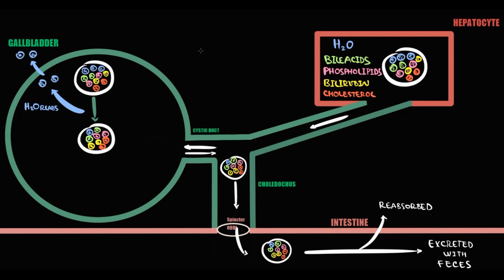Now, we infuse into the vein a radiotracer, which is technetium iminodiacetic acid. Iminodiacetic acid has the same pathway as bilirubin. So initially, by the blood, the radiotracer is delivered to hepatocytes. Then hepatocytes secrete iminodiacetic acid into the bile.